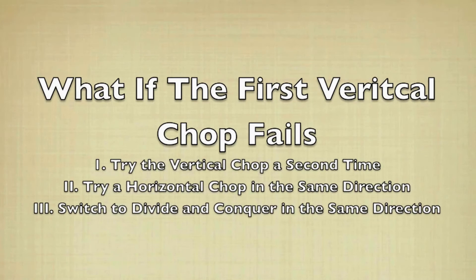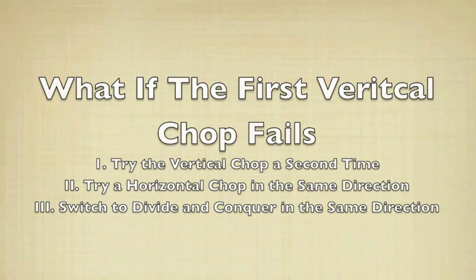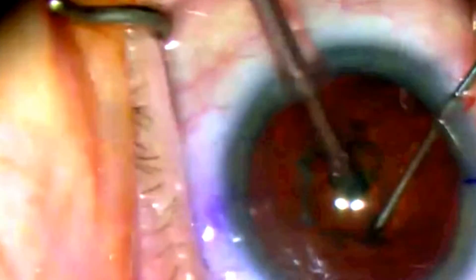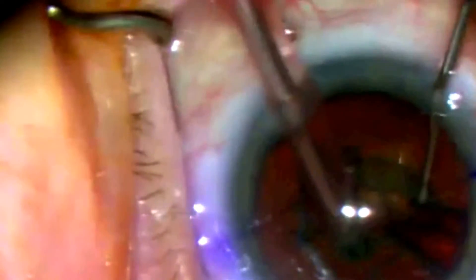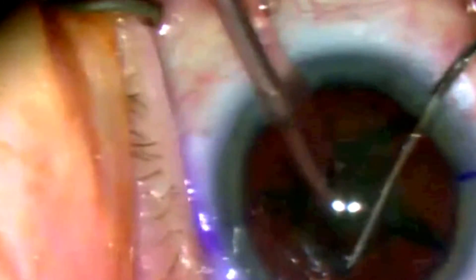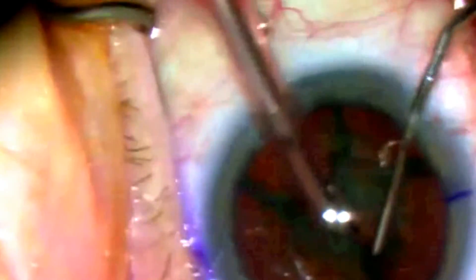Now if the chopping fails there are three things you can do: you can try the vertical chop a second time, just pushing the chopper in and trying to separate the pieces — this often works; you can switch to a horizontal chopper chopping in the same direction as the initial failed vertical chop; or if both of those fail, switch to your usual divide and conquer down the same trough. In this case the lens is all set up, we'll introduce the vertical chopper into the eye, and we'll get our vacuum, but you'll see that on the first chop nothing happens, so we try it one more time. It doesn't really split, then we go one more time and sure enough we're able to split, and then we continue chopping by spearing the lens and pulling them apart — no vacuum needed on this softer lens. We'll keep going around, splitting the lens into about four, five, or six pieces before removing any of them to keep it nicely stabilized.